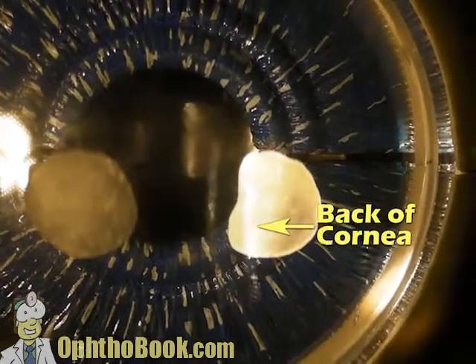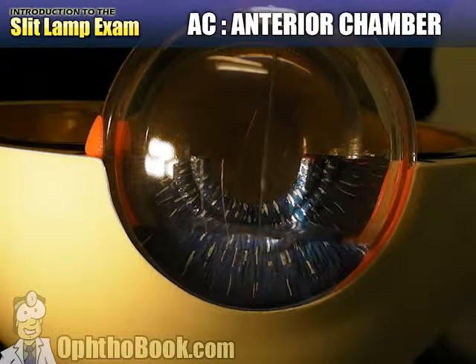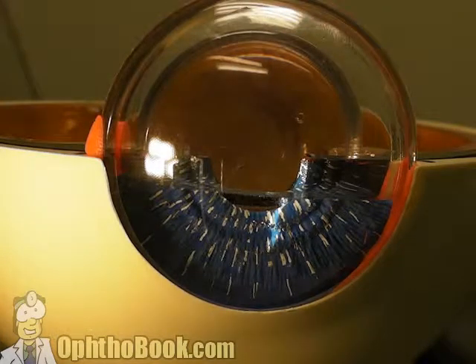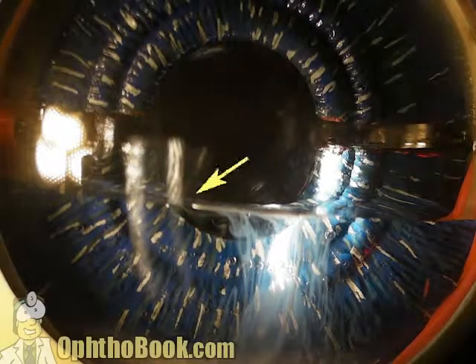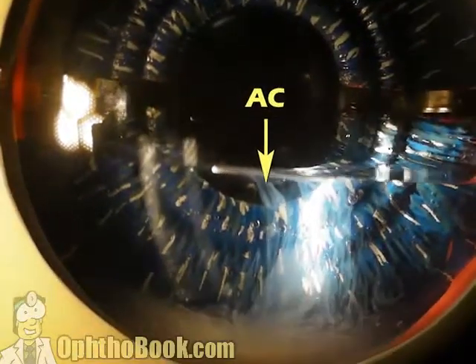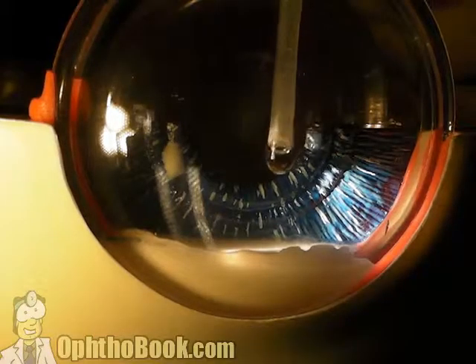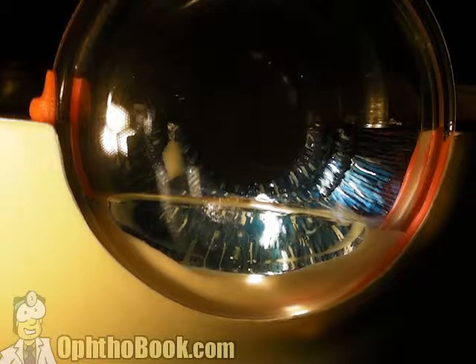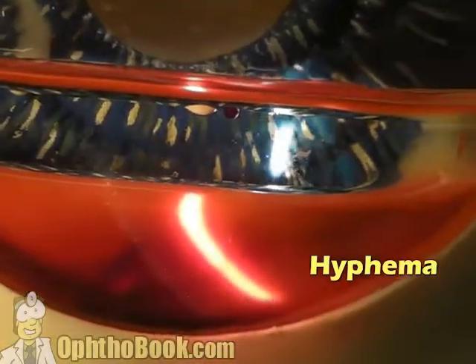Moving on to the anterior chamber — the fluid-filled space between the back of the cornea and the surface of the iris. When looking at the anterior chamber, angle your beam so it strikes the back of the cornea on one side and the iris surface on the other, using the pupil as a black background to see things floating in that space. If there are enough inflammatory cells, they sink and form a layer of pus — what we call a hypopyon. Changing to red blood cells, this is what we call a hyphema — bleeding in the bottom part of the anterior chamber.